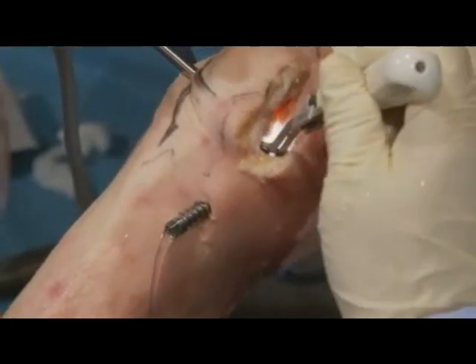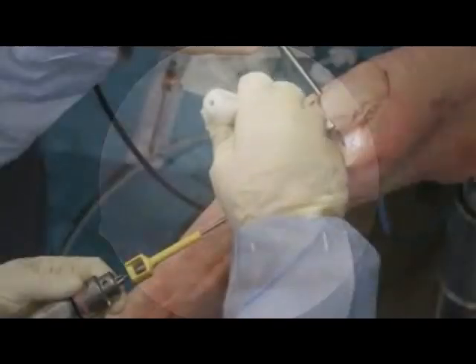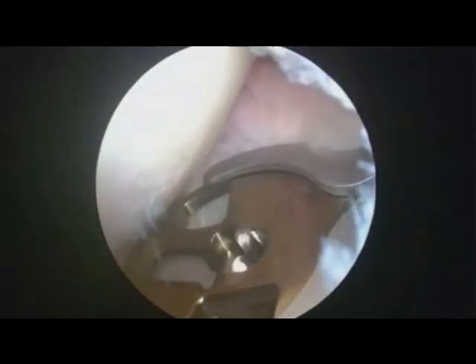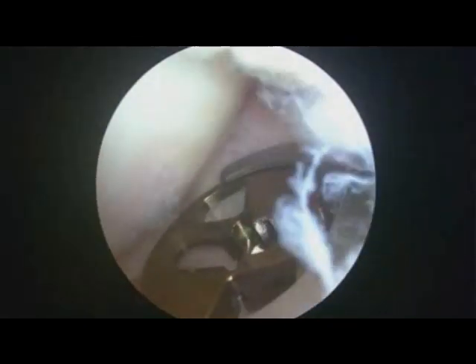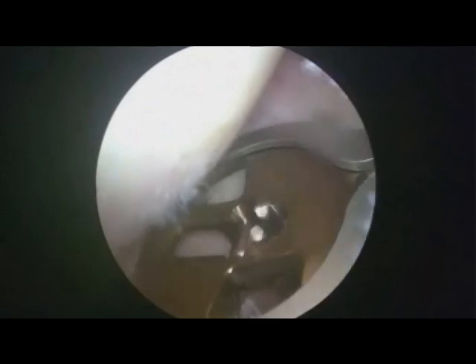So the first thing we do, can we switch back to the arthroscopic portion of the picture? So we insert our blade, and you see you want to center it over the hole that we have. You can see that we come up into our blade, we turn it back, and then we just catch it in the center of the teeth there, so that if you can see right in there, we've now caught our drive shaft and our blade. So now we're ready to cut.